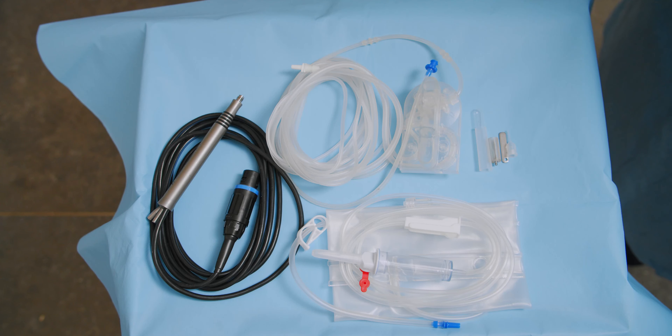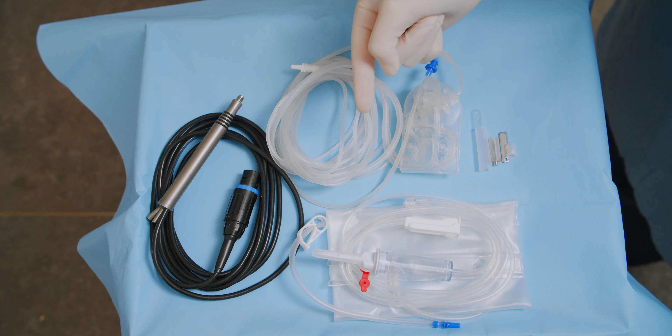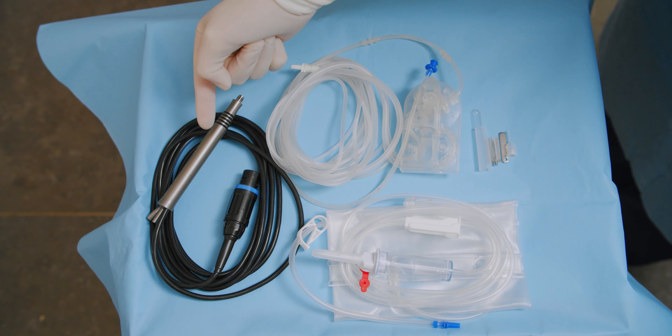Get the handpiece and cassette components ready for setup: FACO tip and accessories, IA cassette with tubing, and the FACO handpiece.